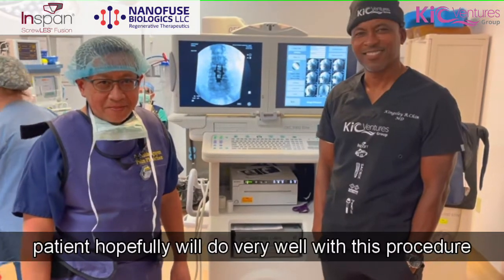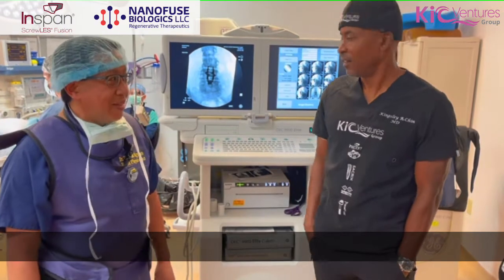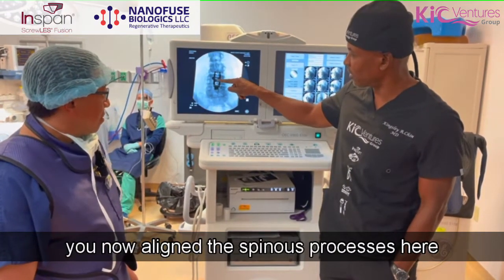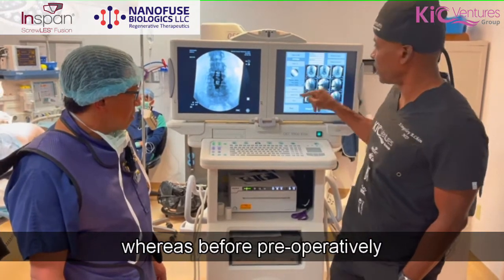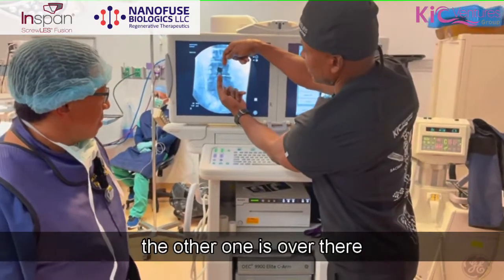So patients, I hope you will do very well with this. What I like about what you did is you now aligned the spinous processes here, whereas before, preoperatively, you can see one spinous process here and the other one is over there.